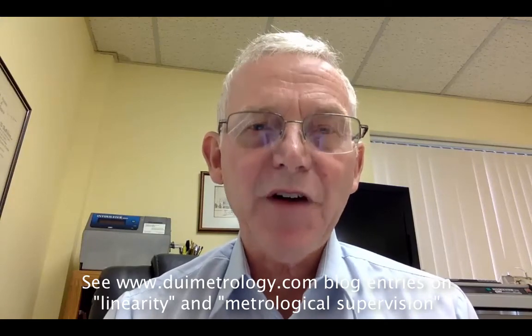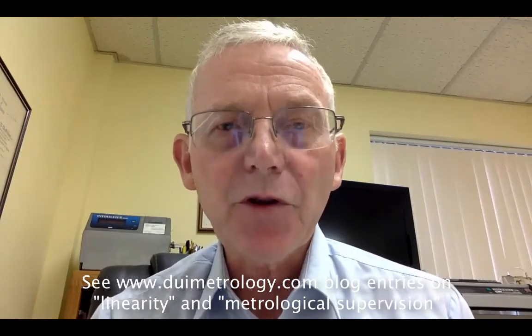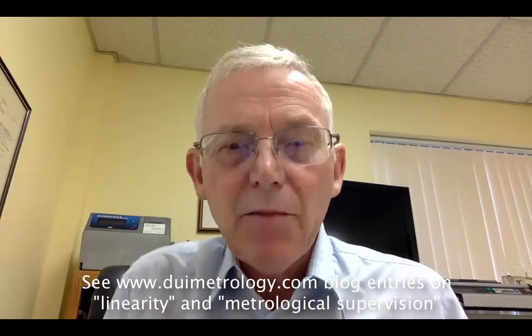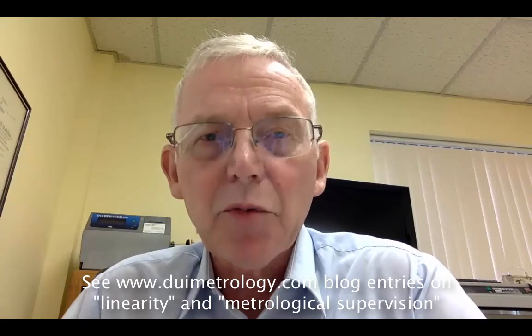It may be that at the time of evaluation of the Intoxilyzer 8000C by individuals working for the Alcohol Test Committee, they found the response to be linear in a new instrument recently calibrated coming from the factory. But there is no empirical evidence whatsoever. Isn't that right, Mr. Expert for the Crown? Isn't it true that there is no empirical evidence to support the hypothesis that any change in calibration of the instrument will be uniform across the calibration curve?